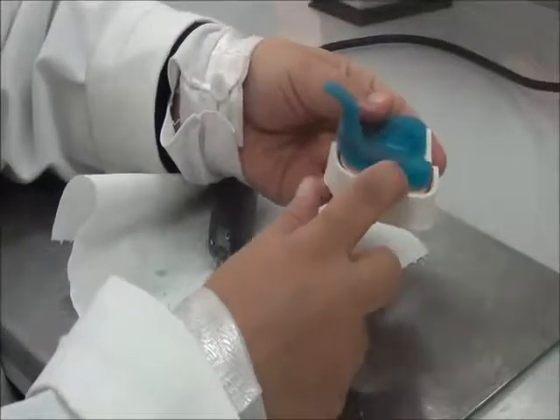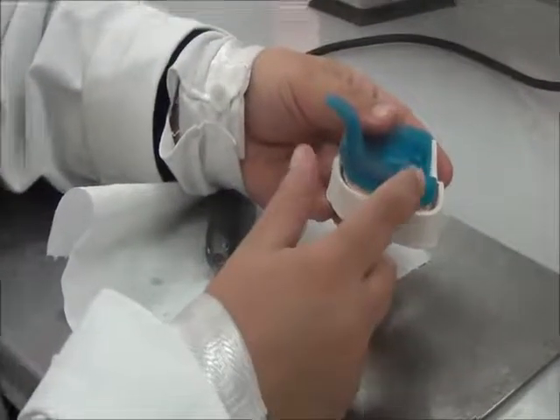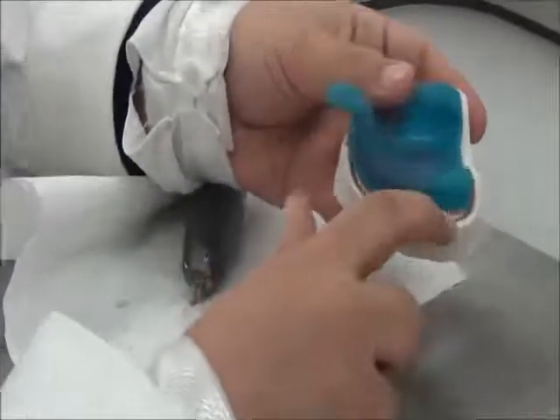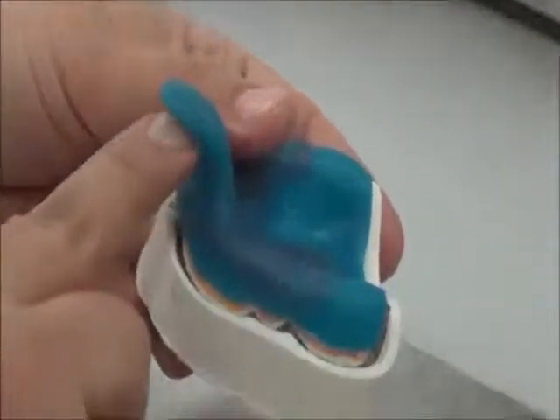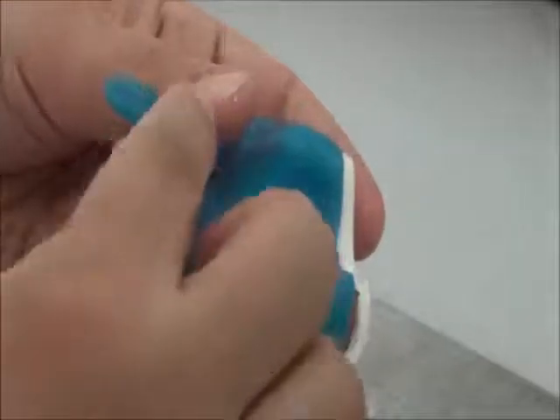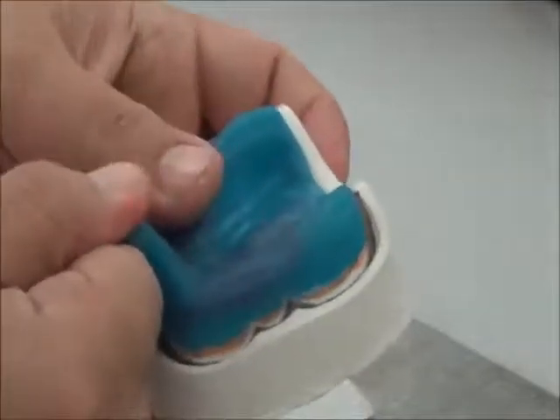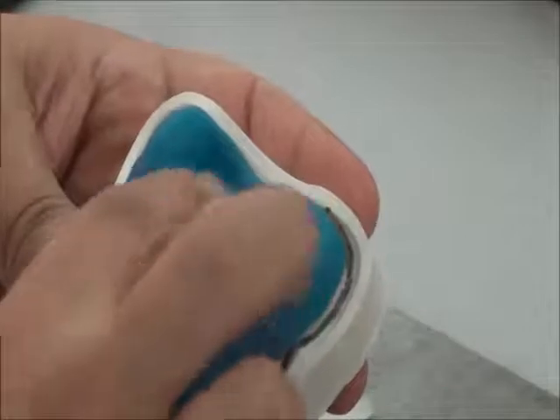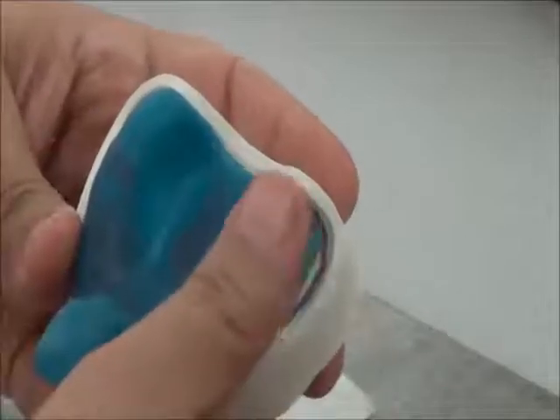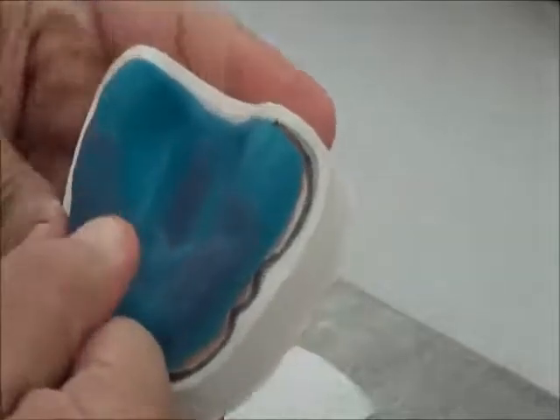For the purpose of training, I have just exposed a bit more for you to see the lines, so the tray is shorter than the sulcus line in this case. The handle is vertical in its first two-thirds. Then it goes to the side where I can get a grip. The surface is all smooth all around. The thickness of the light cure material is uniform all around. I have not overpressed it in any way. And this tray is ready for step number 2.